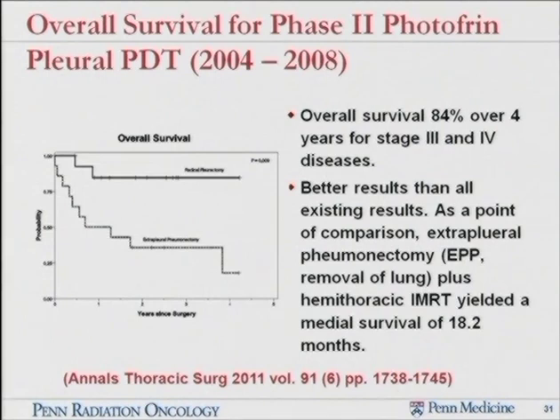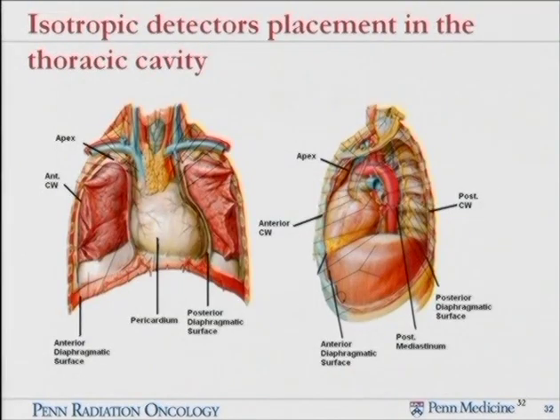So there is actually a difference between a patient with extrapleural pneumonectomy and pleurectomy, and that's the way actually we have been using for all the patients, which basically is to preserve the lung during the surgery rather than cut the lungs out. So we actually have very good outcome data, and hopefully, the PDT can be used to further improve this disease treatment.